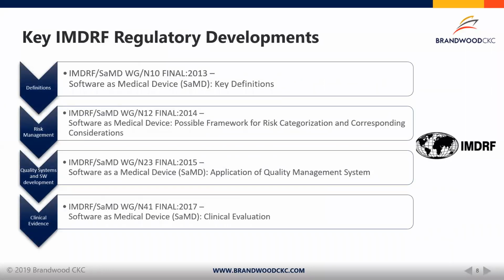So the framework of our presentation today rotates around 4 key topics which have been at the center of the regulatory effort. And here are 4 key documents which have been published by the IMDRF, which is the International Medical Device Regulators Forum. This really shows where most of the effort has been put from the regulator over the years to develop a regulatory framework around software as medical devices.